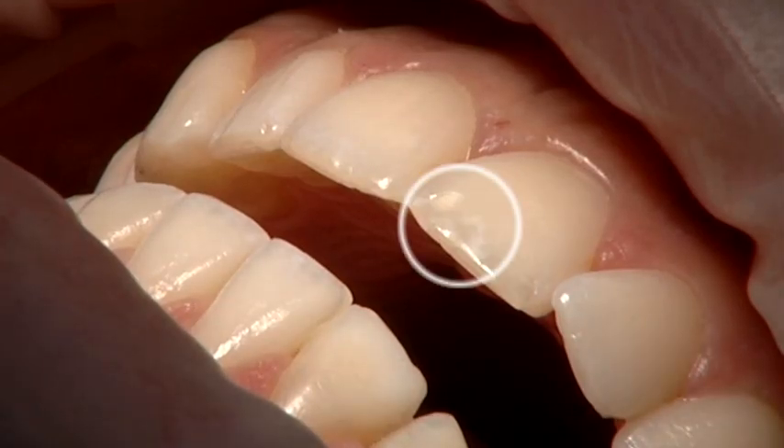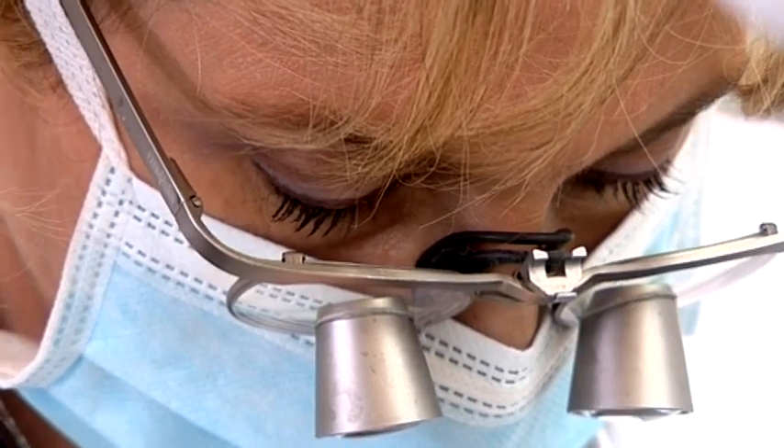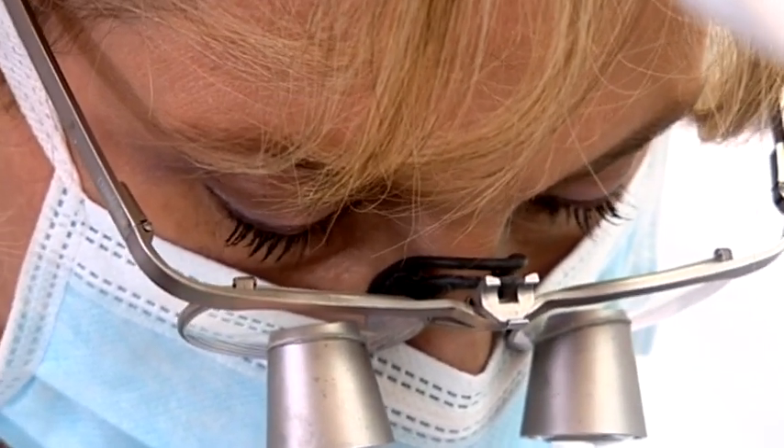Emily has white spot discoloration on her teeth. She's put up with it for 19 years. It's going to be solved in 15 minutes.